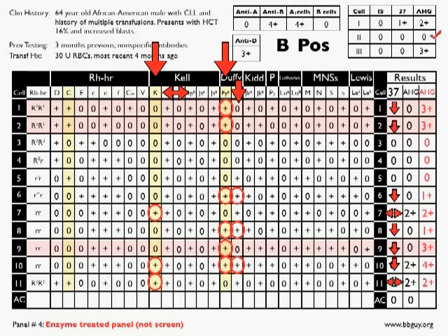All right, the next two we'll look at are cells 6 and 8. Those were 1 pluses, now down to 0. Both of those were single dose Duffy A, now down to nothing. Again, that makes total sense. That's what you would expect to have happen. Next, cells 7 and 11, both stayed completely the same, did not change at all. Well, perfect fit because both of those have only big K antigen, and you wouldn't expect the big K antibody to show any change in reactivity after proteolytic enzymes.